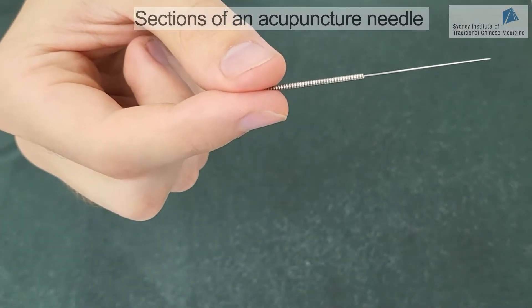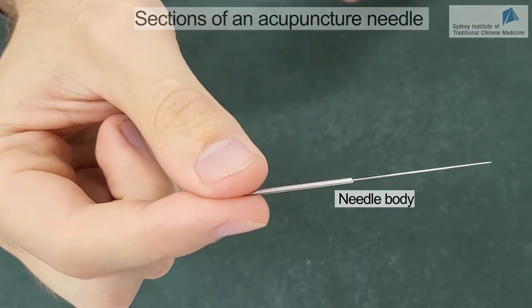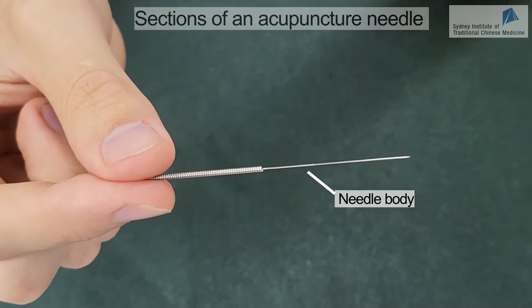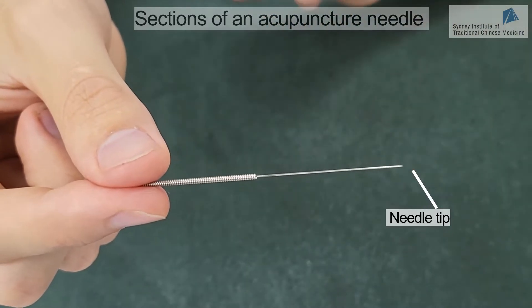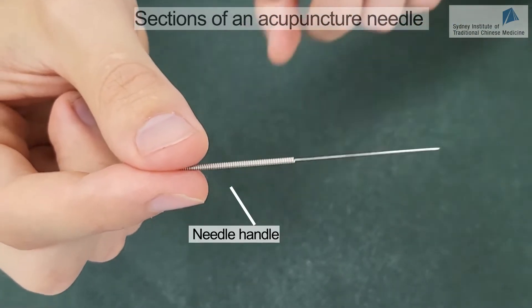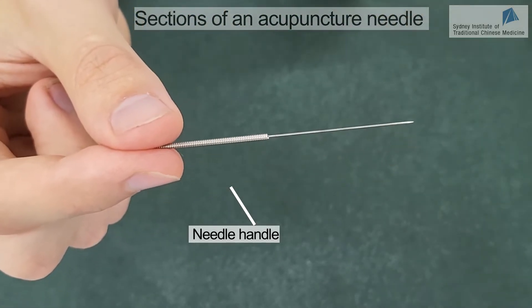Let's start with the different sections of an acupuncture needle. Here we have the body of the needle, which is the part that is inserted inside the body of the patient. At the end of the body, we have the tip, which is the section that penetrates the skin first. Then we have the handle, which is the section where the fingers hold the needle.